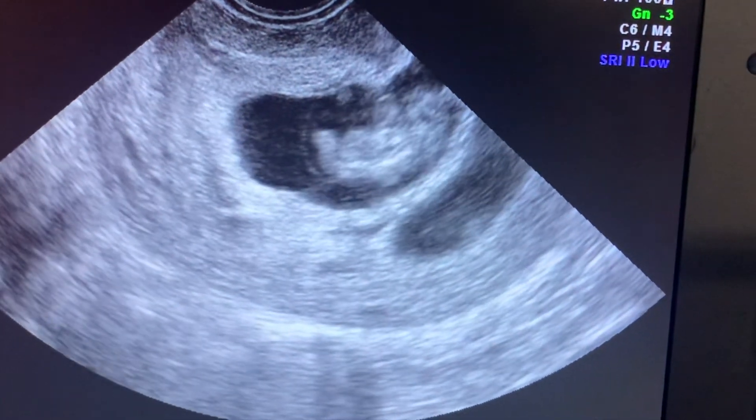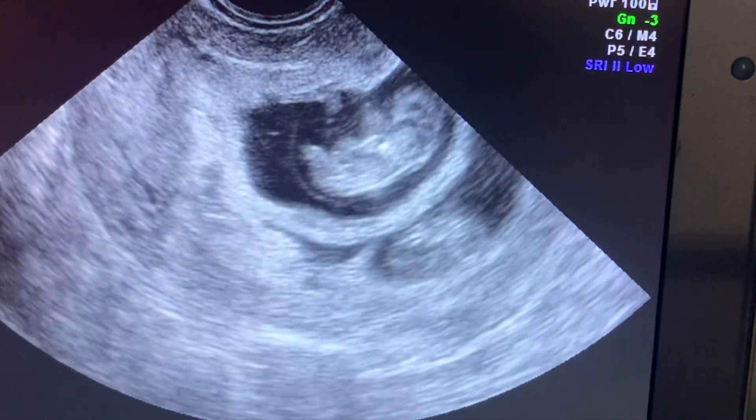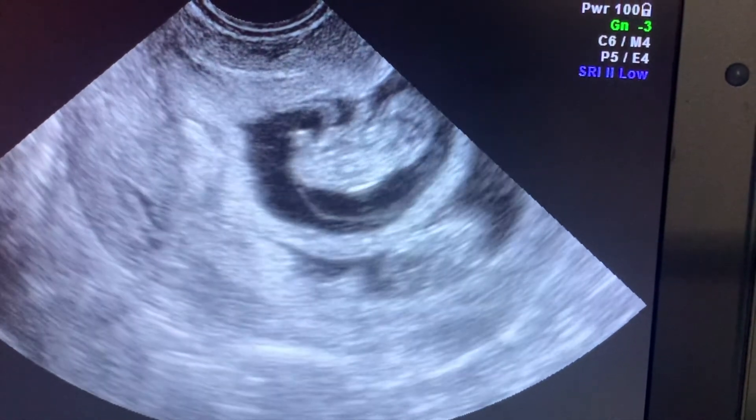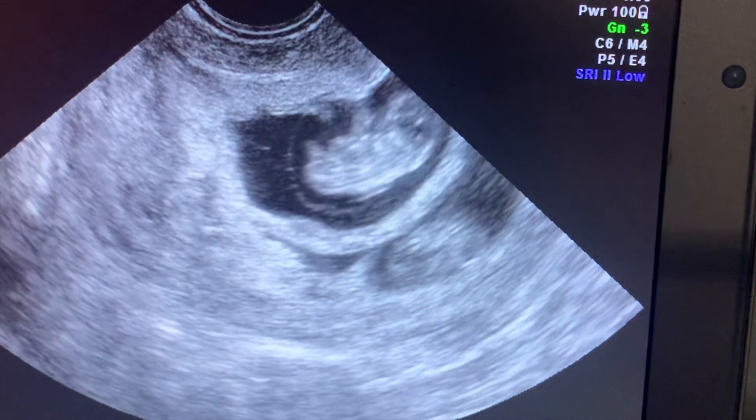In this screen we can see two fetuses. The one above is the one which is closest to the needle once we pierce the uterus, and that is chosen to be reduced.